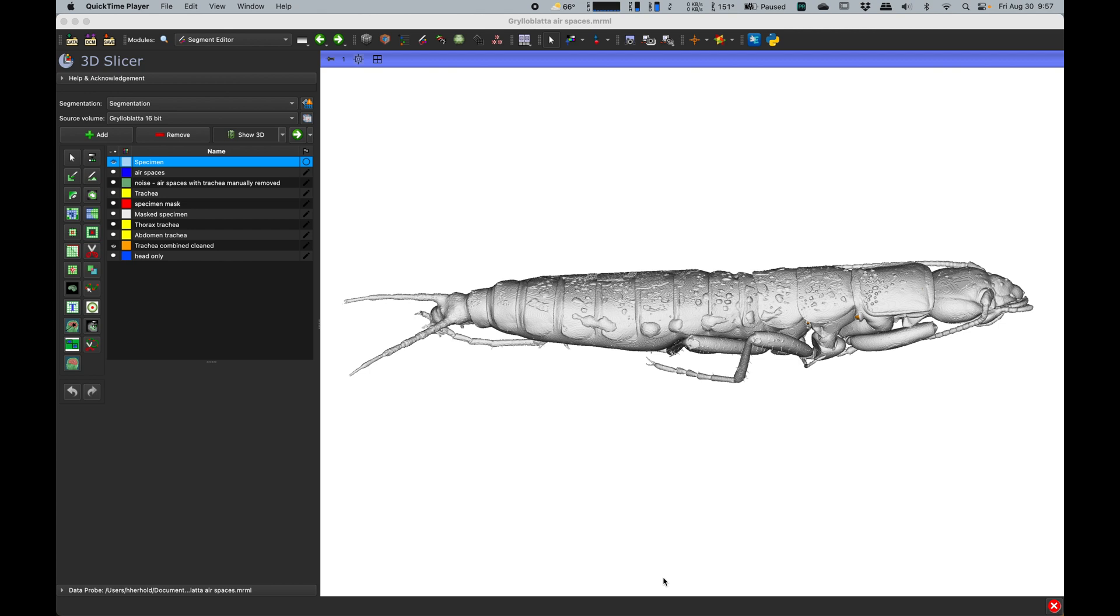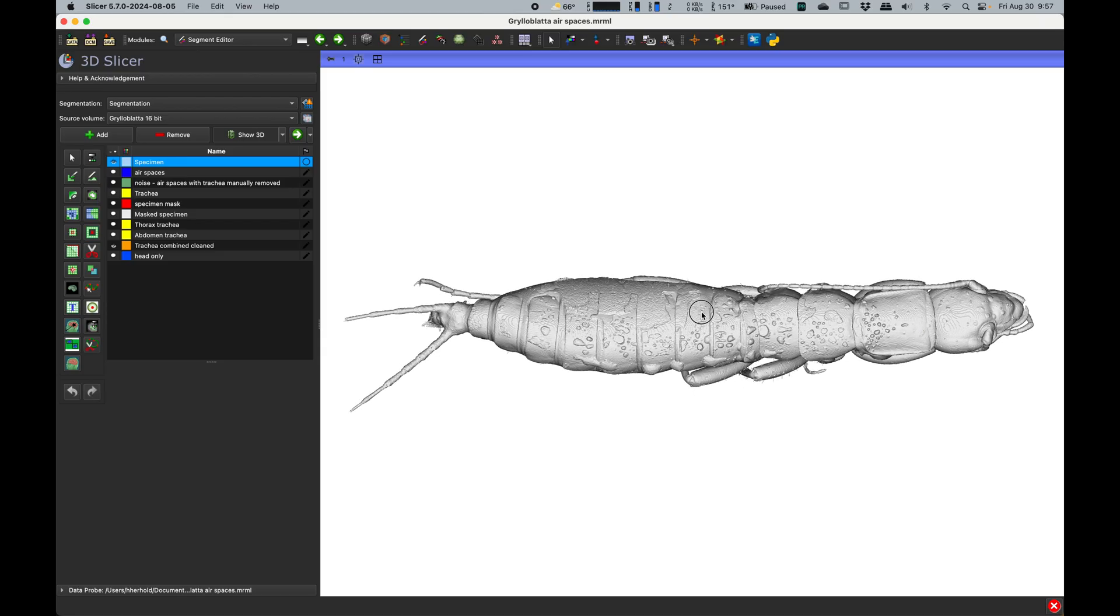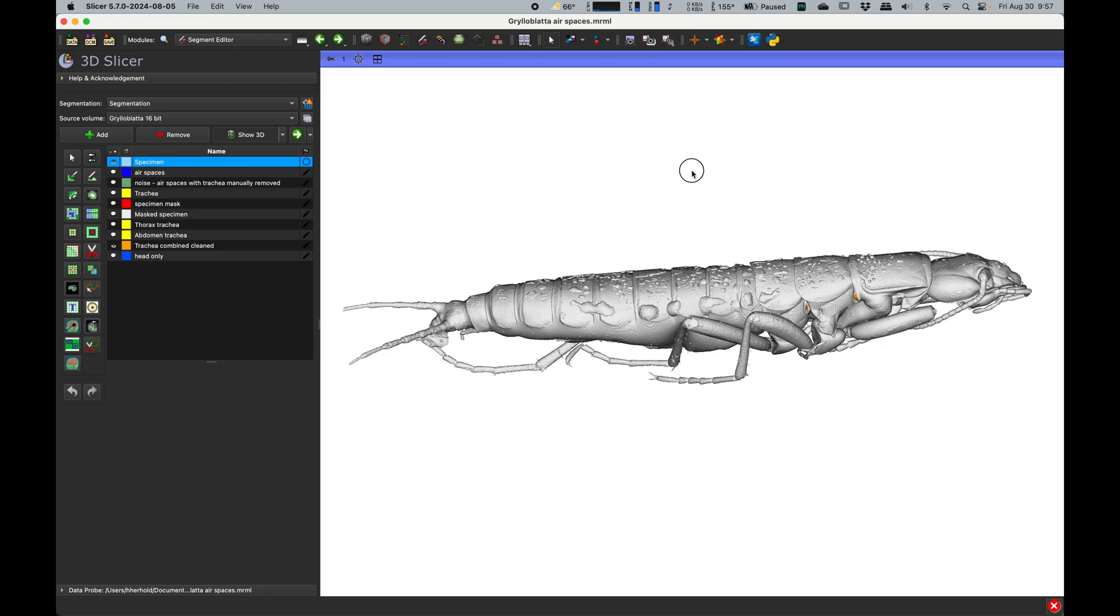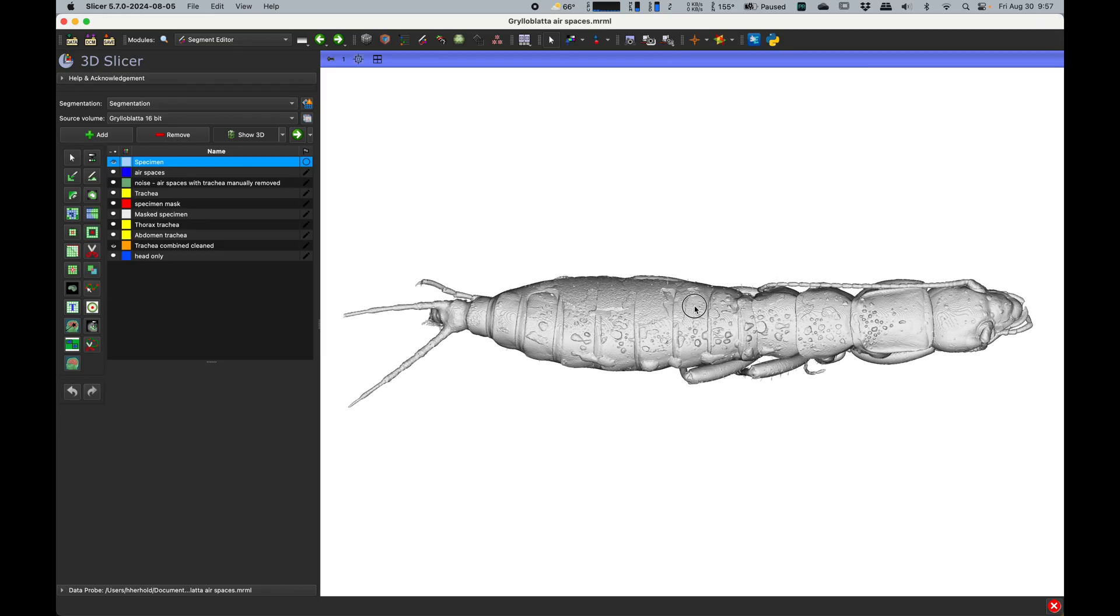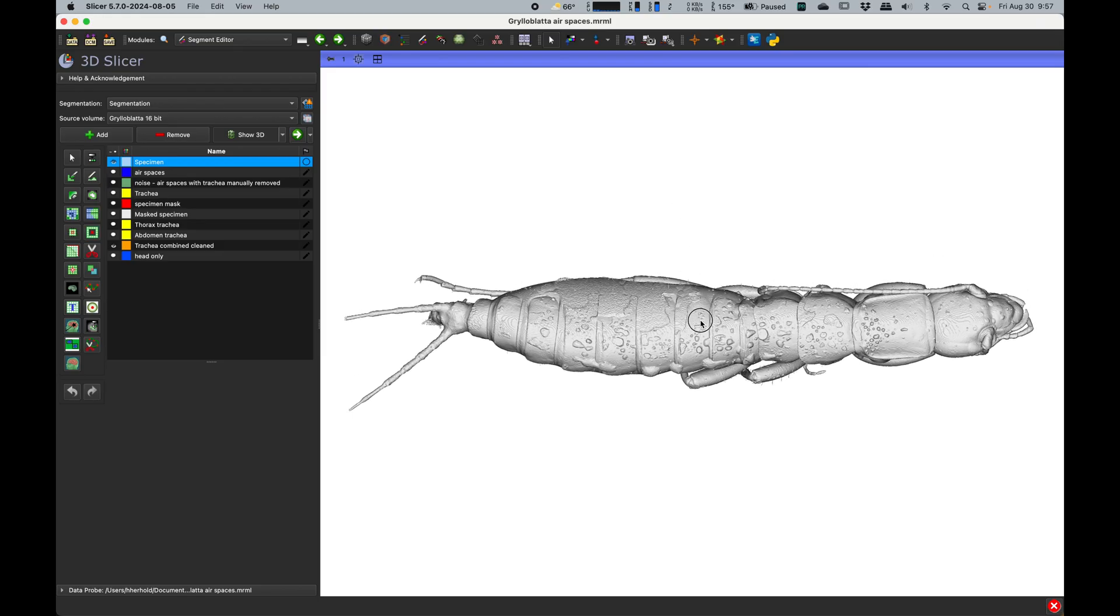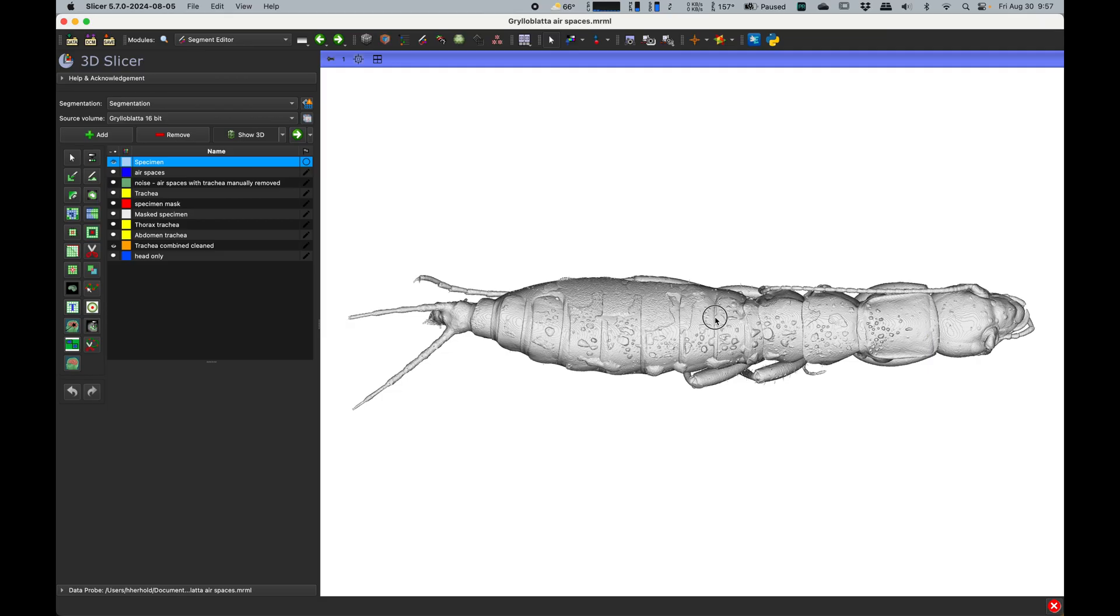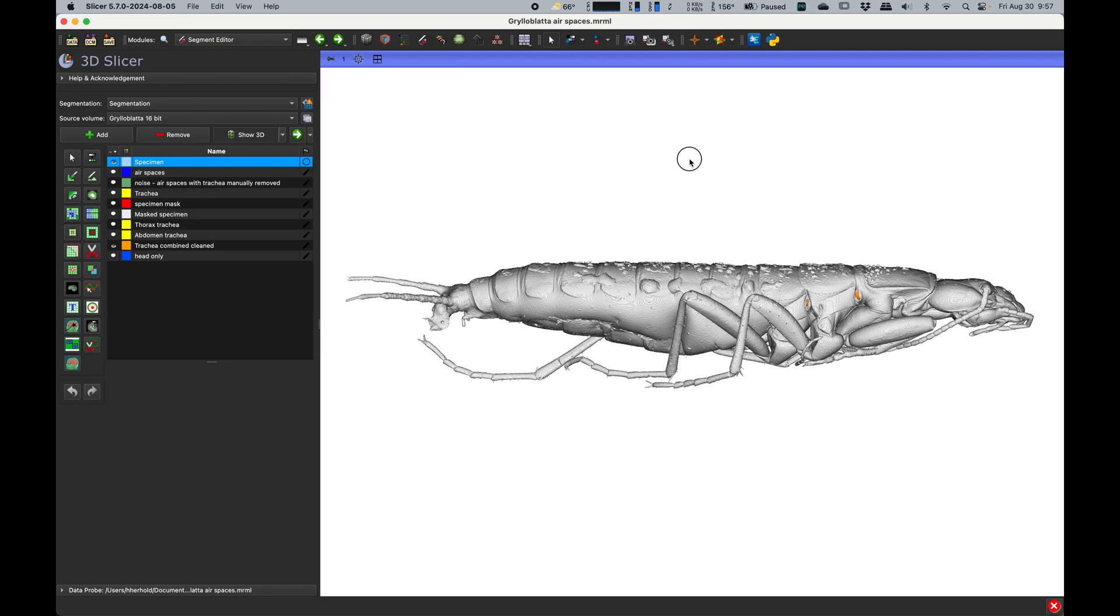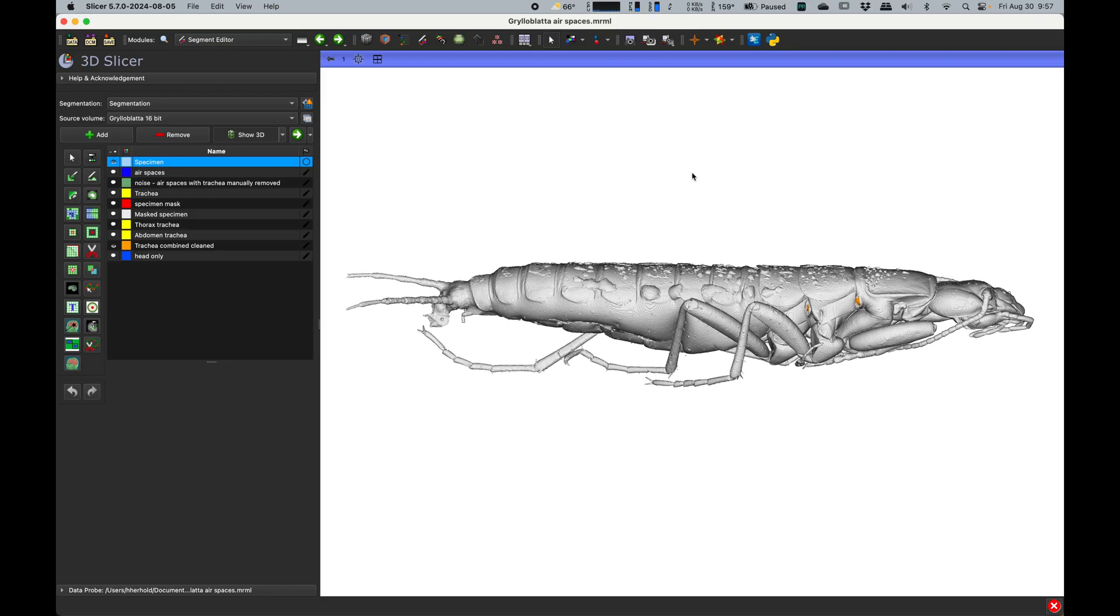This is a quick video to demonstrate how to export segmentations from Slicer as 3D models that can then be imported into Blender or any other 3D application you might want to use for high-resolution rendering, animation, surfacing, fancy lighting, or flyover animations.